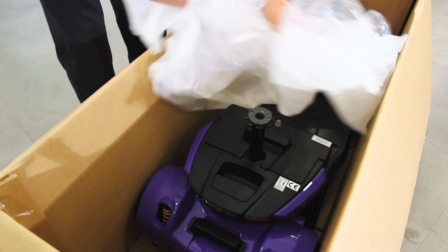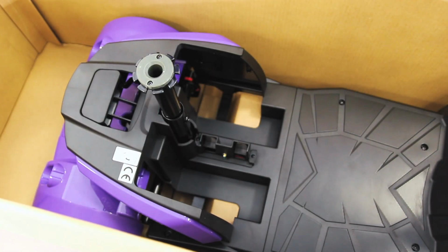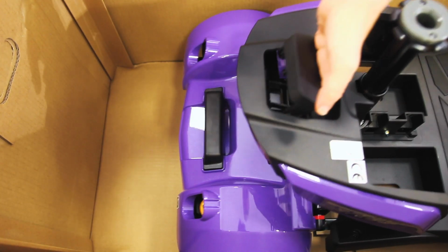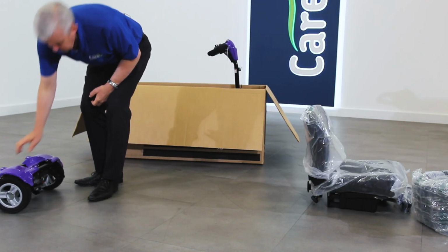Now you can access the main scooter body. Using the seat post for support, lift off the battery and set it aside. Lift this lever on the rear to separate the front and rear sections. You can now lift out these two sections separately at a more manageable reduced weight.